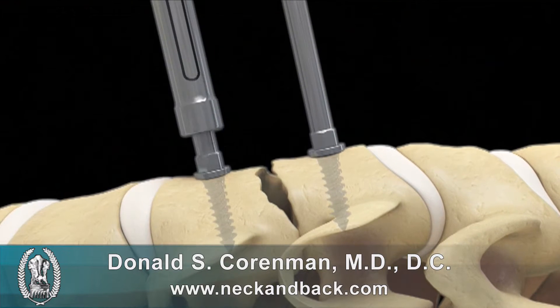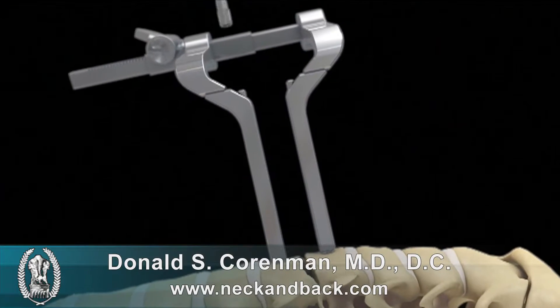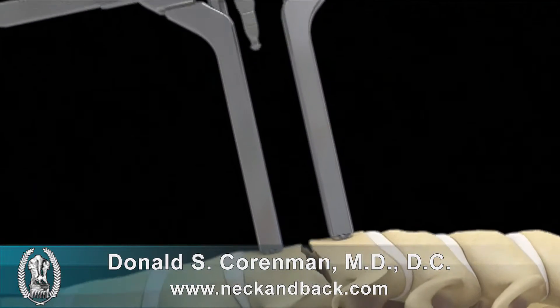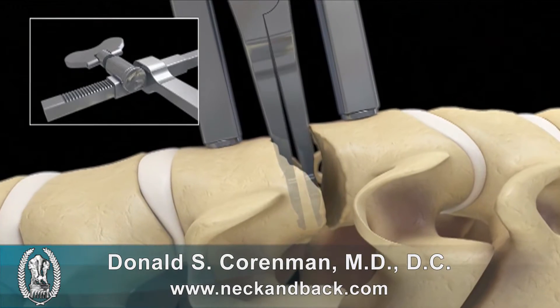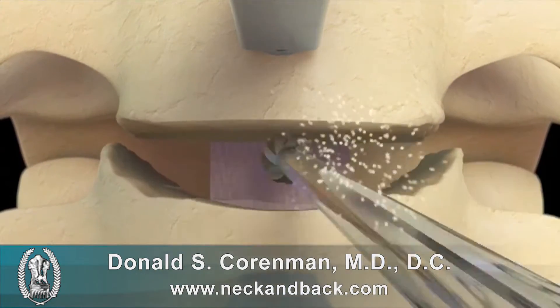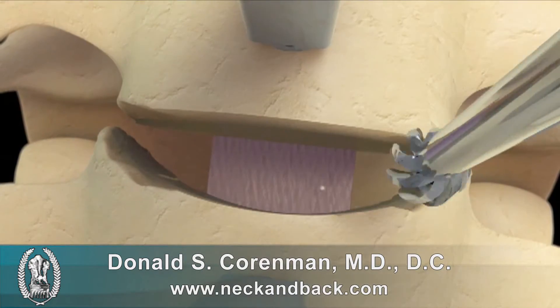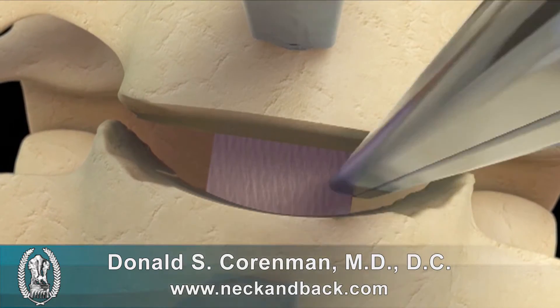You want this hole and the guide pin to be parallel to the disc space and a certain distance. You can then distract the disc space somewhat. There are many different tools; this is one of the tools you can use. Preparation of the disc space is essential. You'll see here that the disc space is reduced from being round to more parallel.